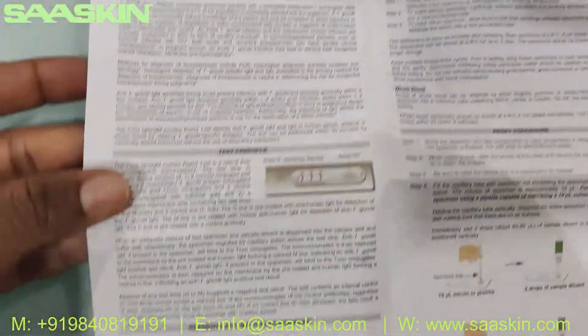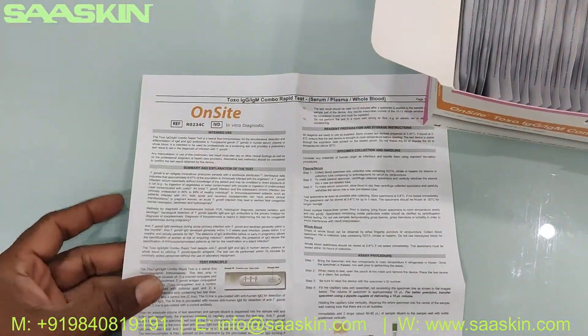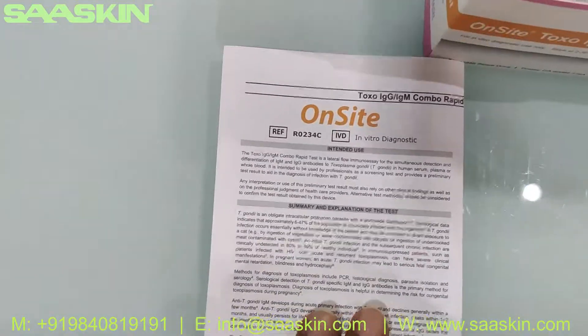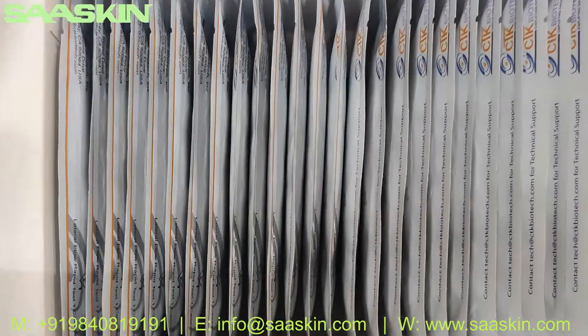The IFU brochure covers everything from sample preparation to the testing procedure and how to interpret the results. The total procedure is outlined here, so you get a complete guide to conduct your test from this brochure.